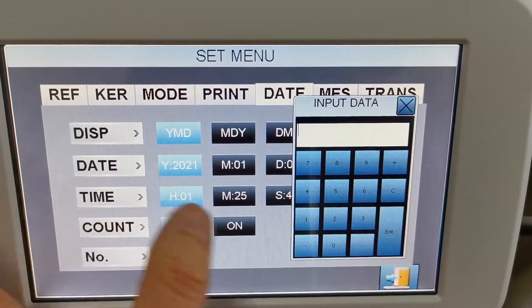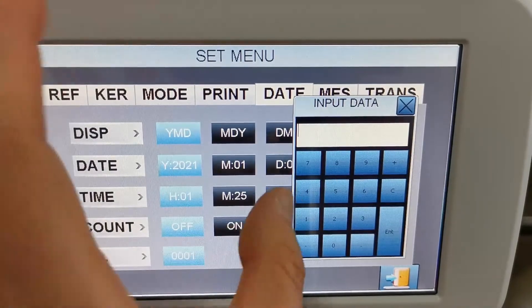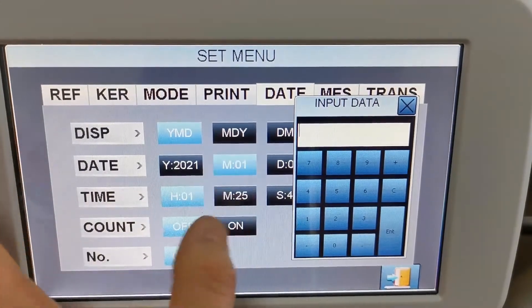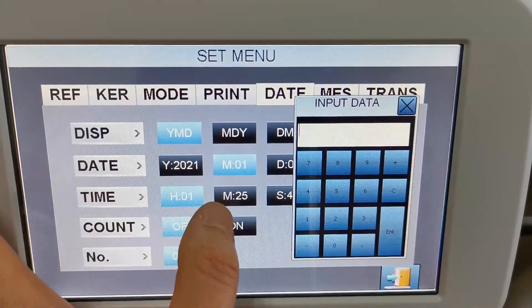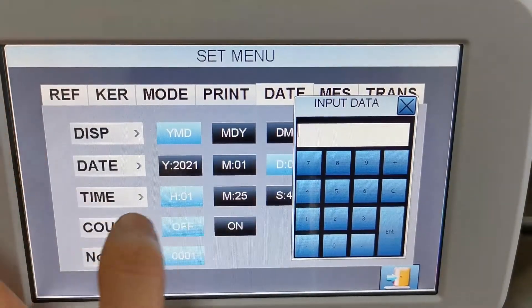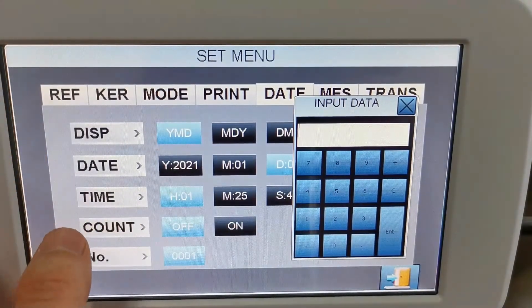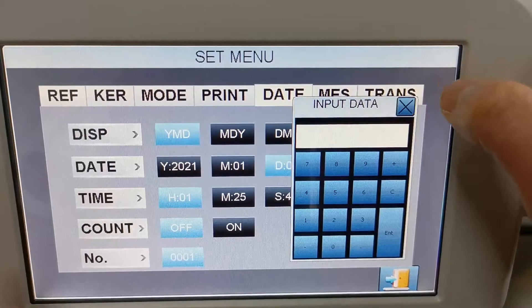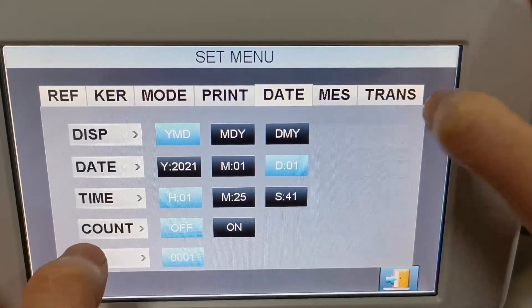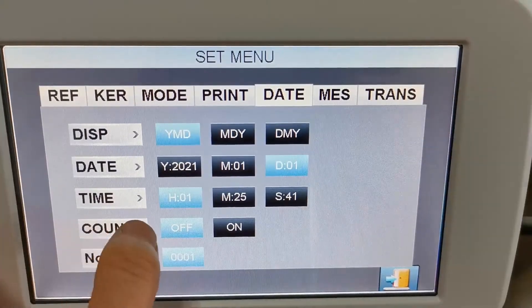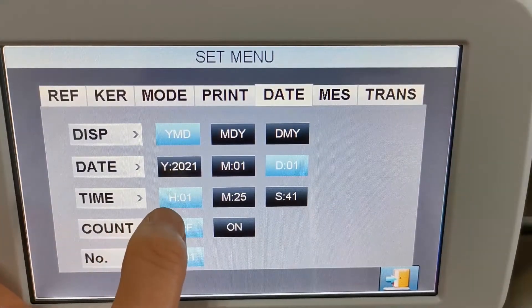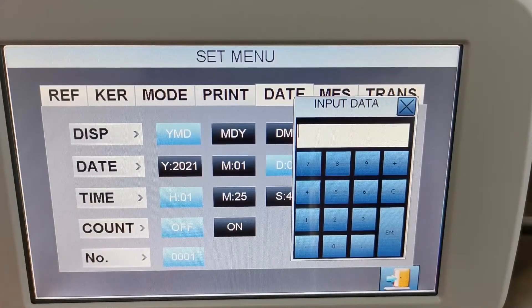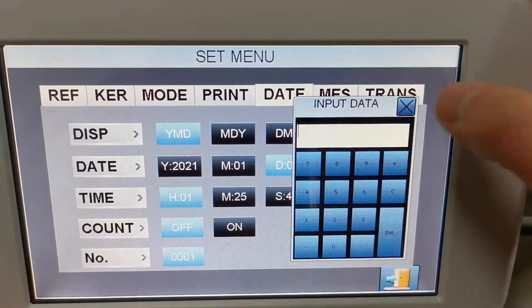You can input the correct date, month, and day. And here is the time setup — it works the same way, and you can put in the correct time.